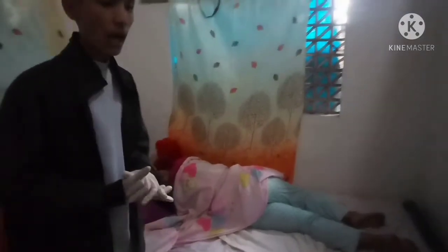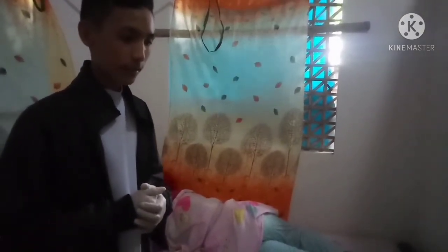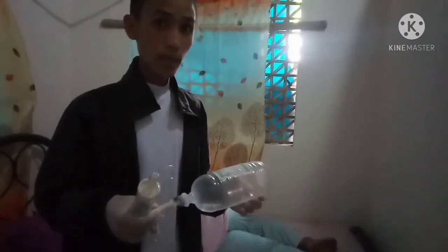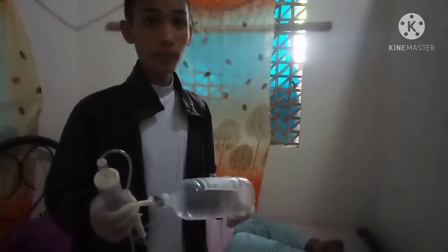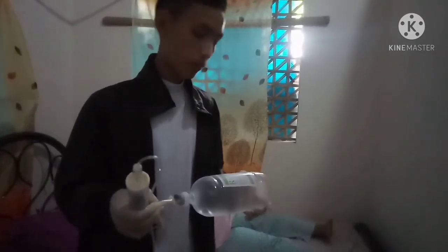This time, we will prepare our enema and make sure that we will use warm water. We will infuse it, depending on the prescription of the doctor, it may be 250 ml or 1 liter. Make sure that the water is not cold or too warm because it would affect the client, especially during the procedure.